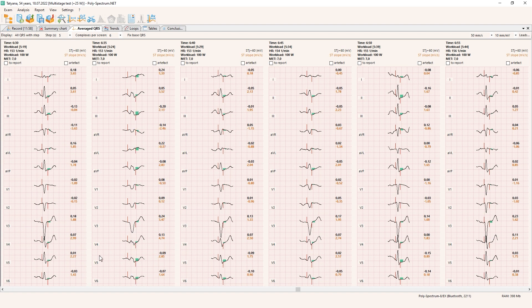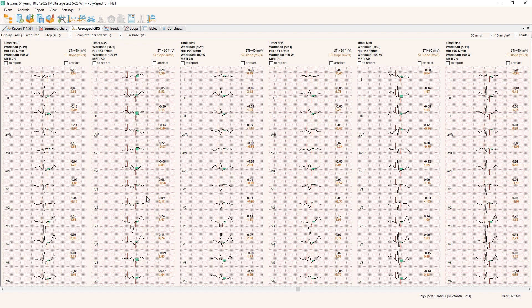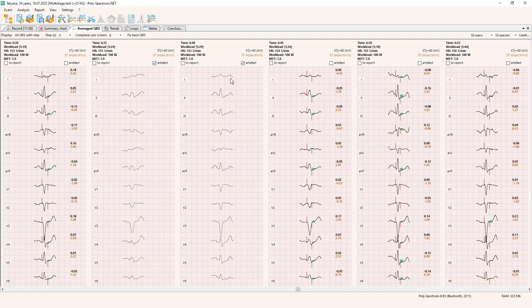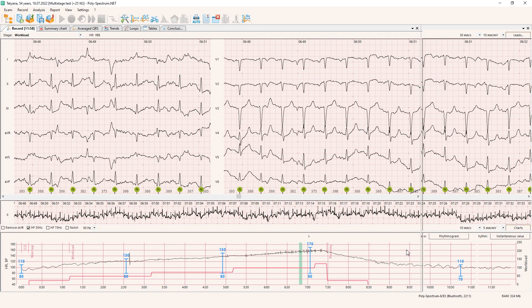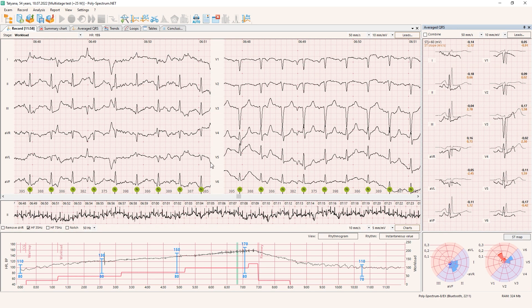We can have some errors in the analysis algorithm — for example, the mark of the end of the QRS complex was not correct, but I can correct it by dragging with the mouse. If I see a change like this, that's almost one millimeter of ST depression, that may be confusing when another specialist views this in the report. So I have an option to mark these averaged complex artifacts to exclude them from the analysis.